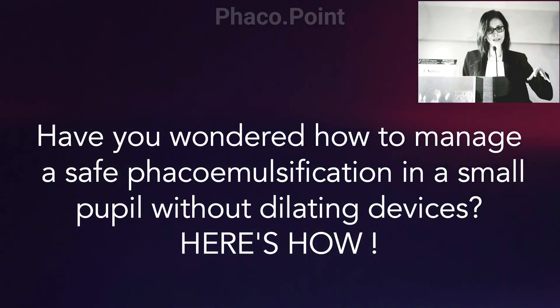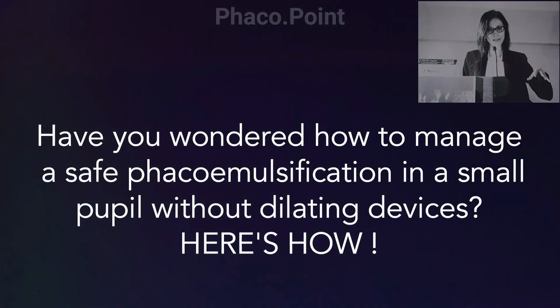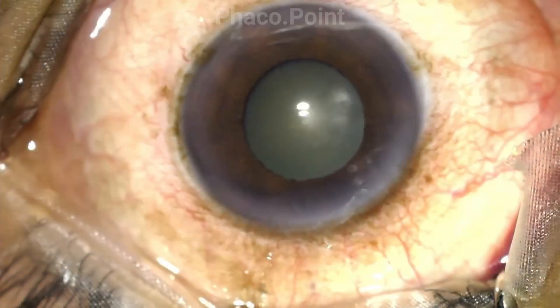In the following video, I'd like to demonstrate the technique of a safe phacoemulsification for a patient who presented with a grade 2 nuclear sclerosis and a pupil of 4 to 5 mm. I'd like to share the various principles of managing a small pupil phaco without the use of any dilating device. Let's move to watching the video.